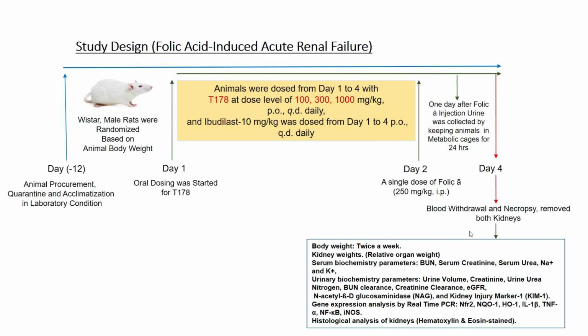On that we can conclude what the disease induction level is, meaning how much it is induced. By that we can confirm whether it will work or not, whether it recovers or not. After 7 days, during the standardization process, we have to check again whether it is showing induction or not. If it is showing induction, then we can continue this model for 7 days. Otherwise we have to do this experiment for 2 to 4 days. That is more than enough.